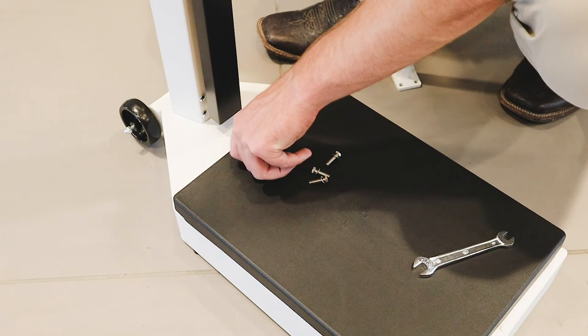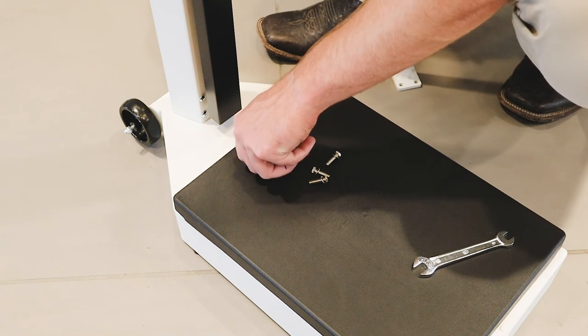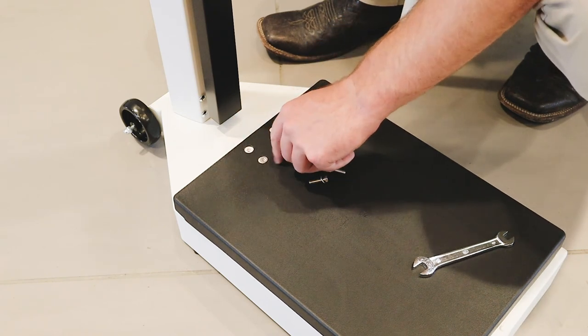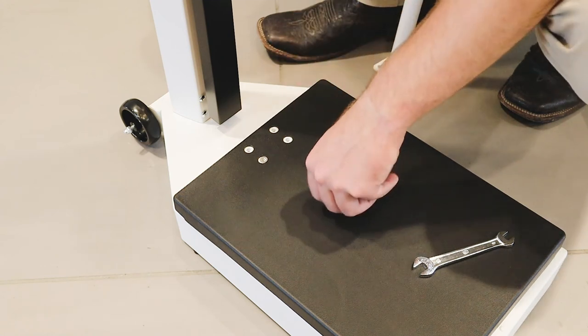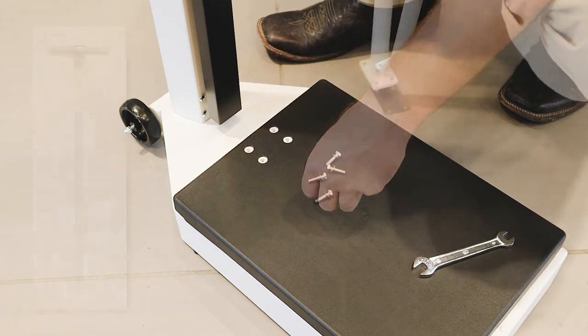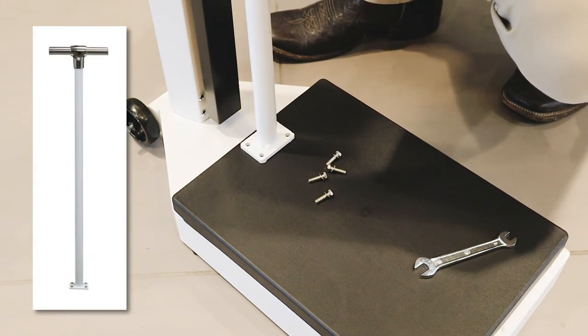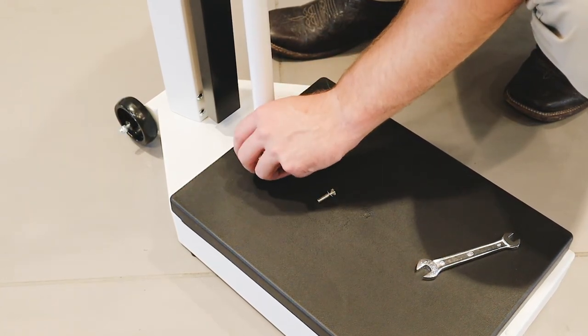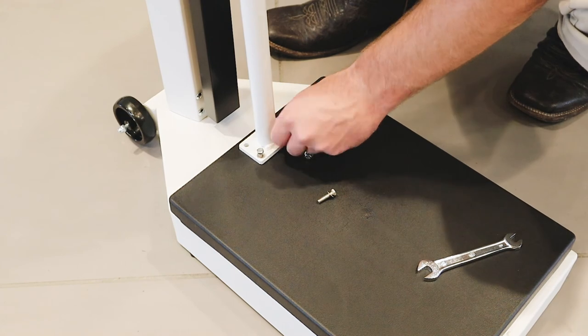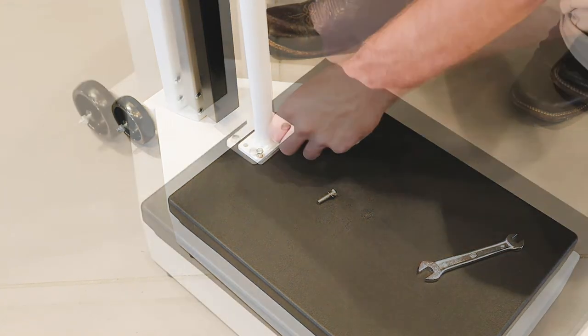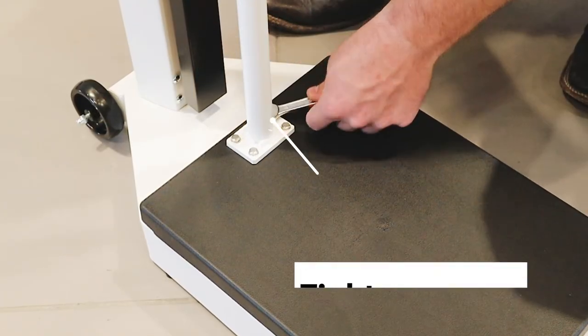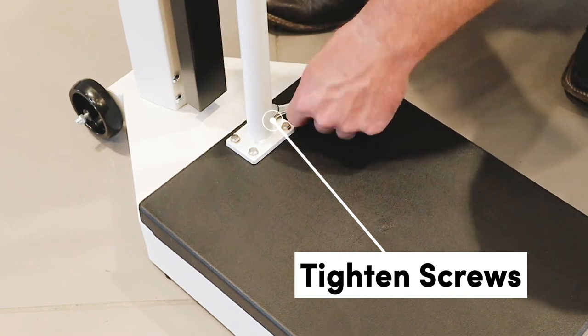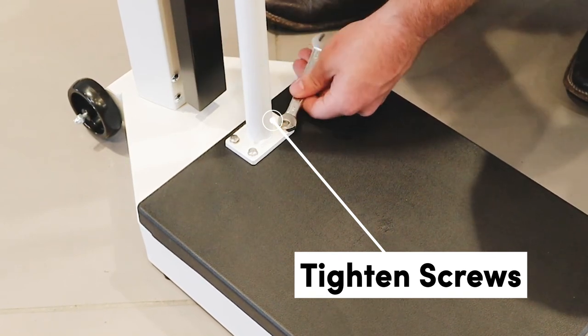If your scale is a model that includes the hand post, remove the four hex head screws and washers from the scale platform and set them aside. Place the hand post onto the scale platform, align the holes in the hand post with those in the scale platform and then install and finger tighten the four hex head screws and washers. Using the provided wrench, tighten all four hex head screws to secure the hand post to the scale platform.